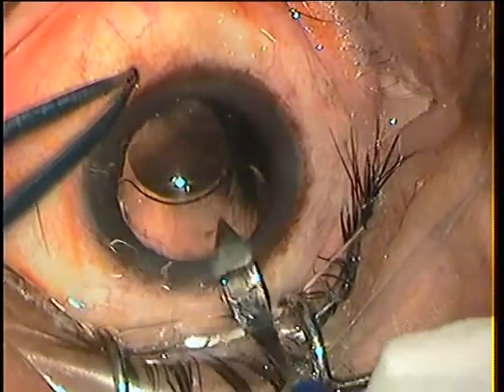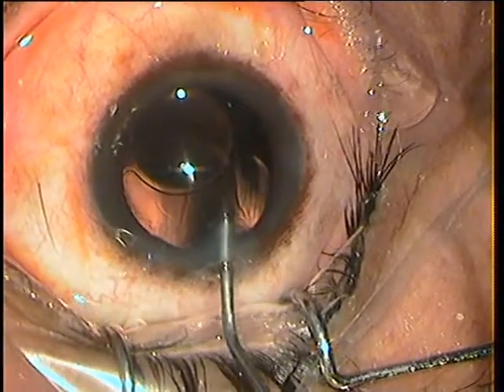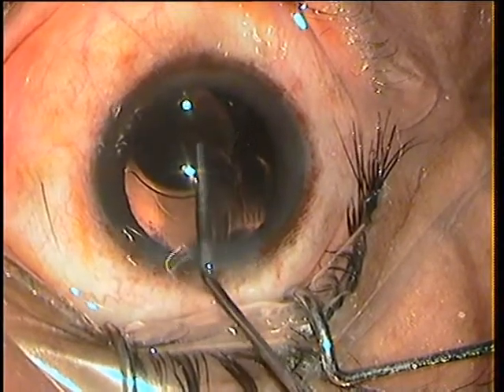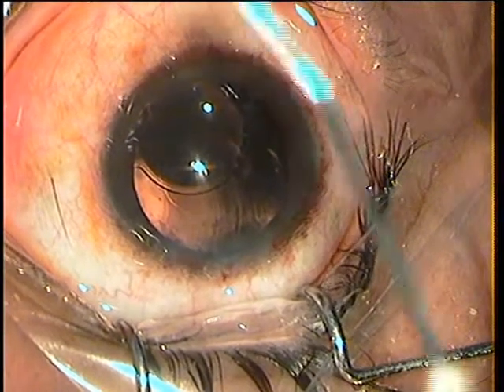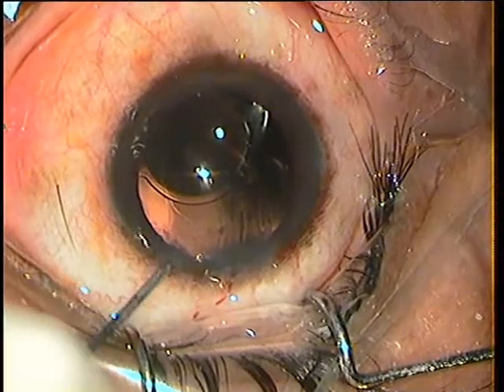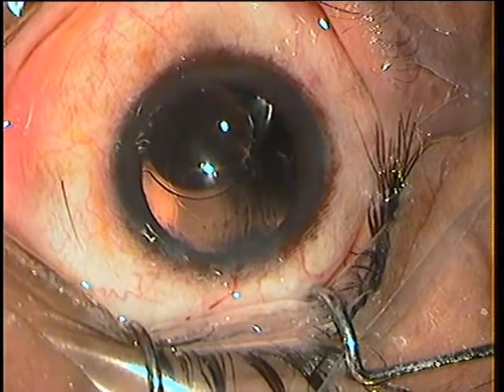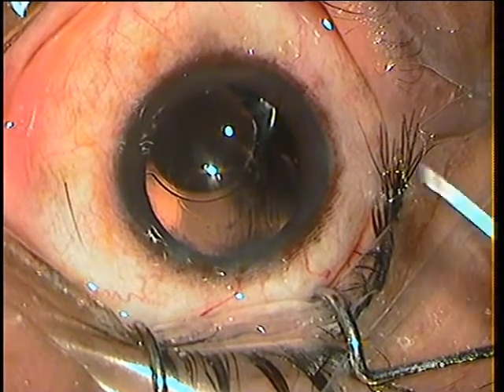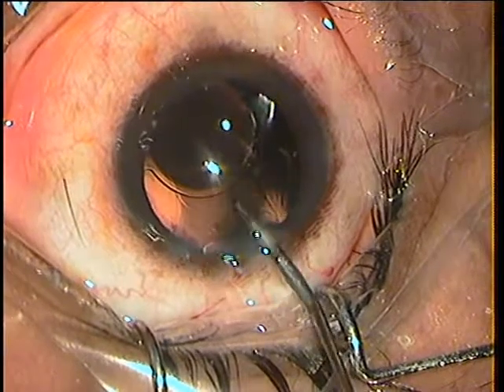I took up the case to explant this lens and insert a new one. The case was done in the morning. At the conclusion, I realized that one haptic had been broken off and the lens was a bit decentered. I closed the case, waited a few hours, and in the afternoon when I reviewed the case, I decided I had to remove this lens and put in another one.